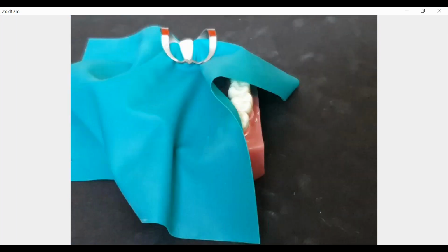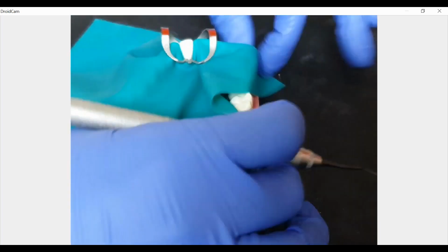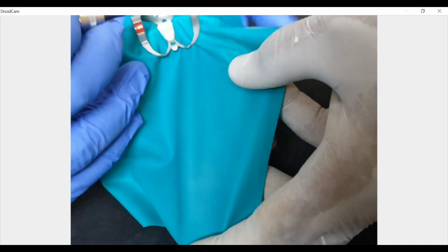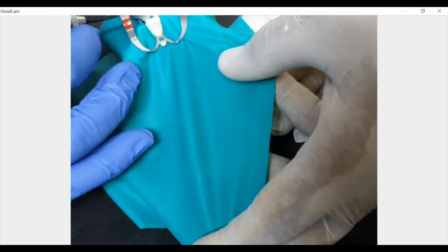So once you engage it, this is how it will look. Now again, you have to remember that these are the wings which need to be reflected. So reflected off. As I said, try to raise it and then lift it.